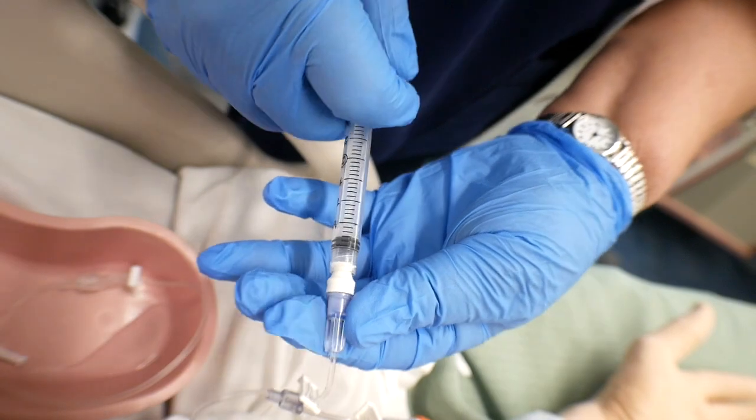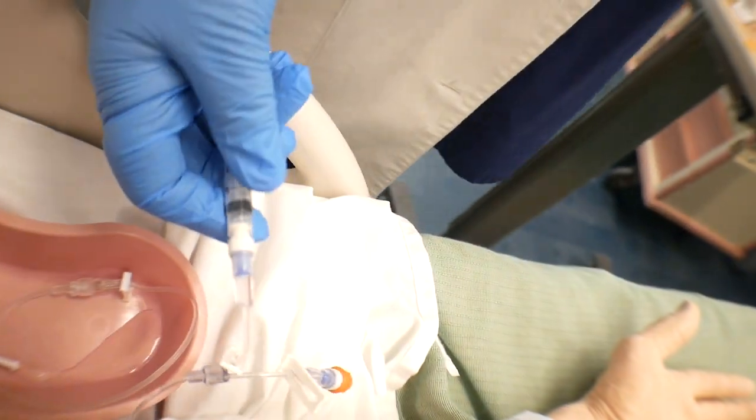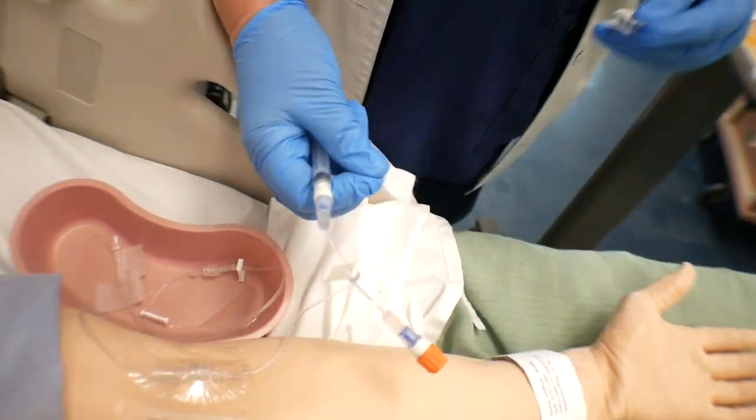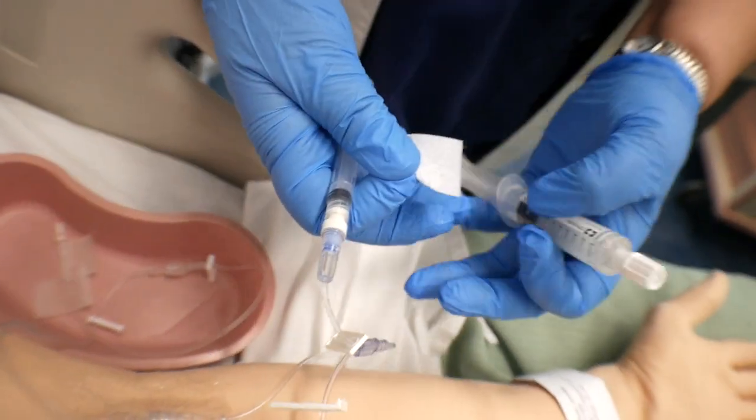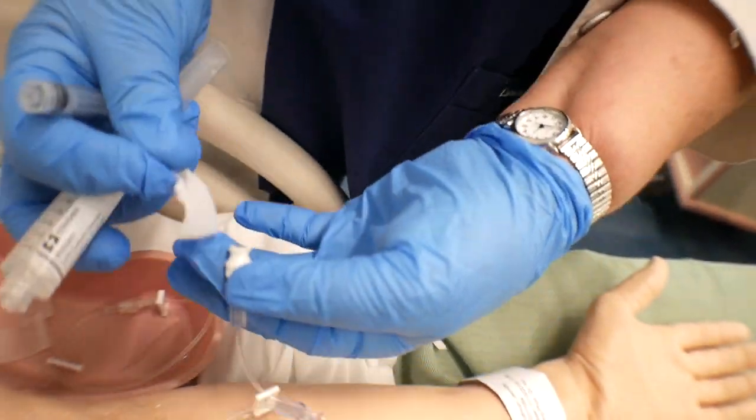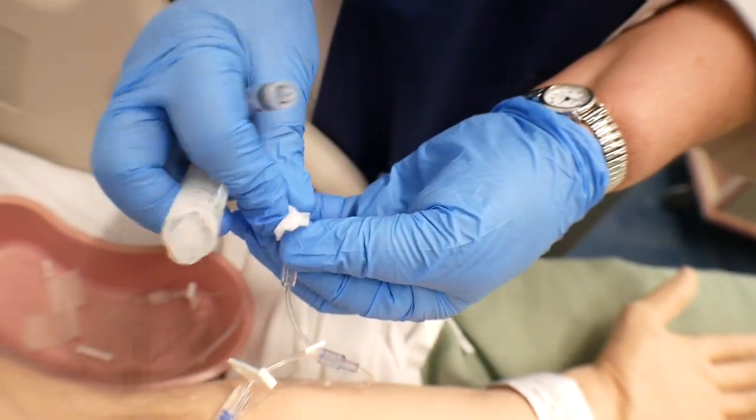So I almost got it exactly. So I'm going to take this off. So it still has a little bit of medication in the line. So I need to take this syringe off, put my new one on. So I'm going to clean it again in between.